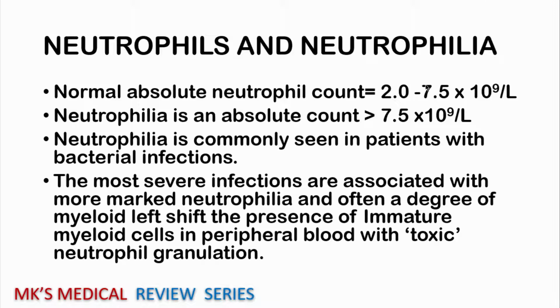Neutrophilia is going to be common in patients with bacterial infections, and the most severe infections are going to be associated with marked neutrophilia, and often a degree of myeloid left shift is going to be indicated by immature myeloid cells in the peripheral blood with toxic neutrophil granules.